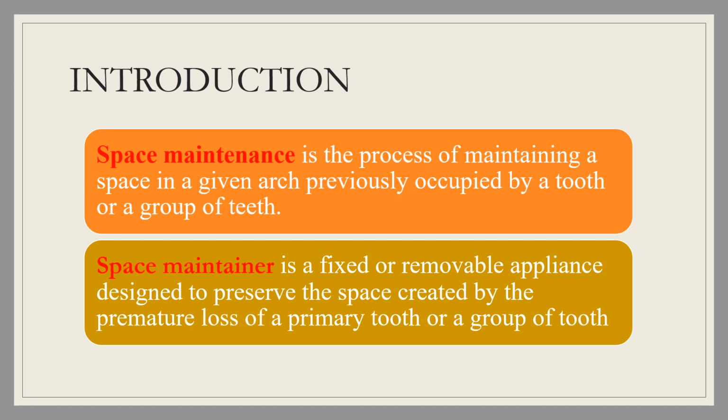Space maintainer is an appliance. It's a fixed or removable appliance which is designed to preserve the space which is created by the premature loss of a primary tooth or a group of teeth. So space maintenance is the process and space maintainer is the appliance.